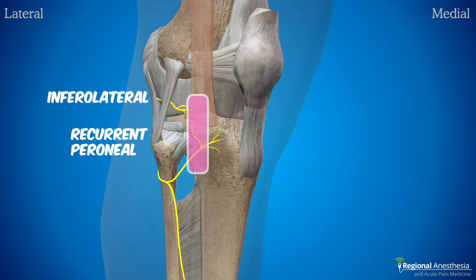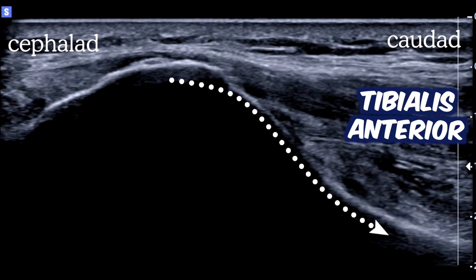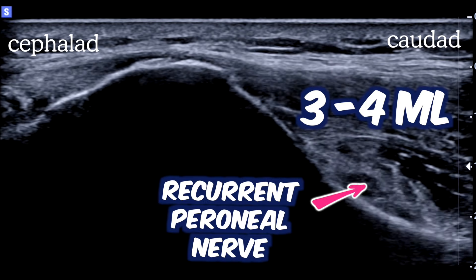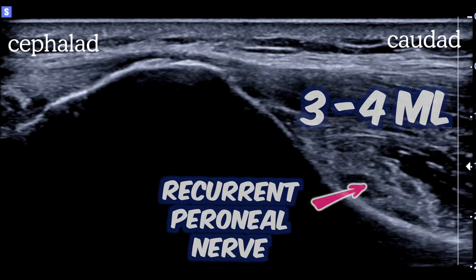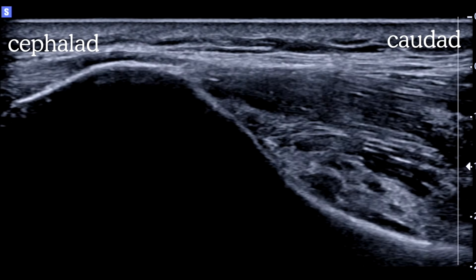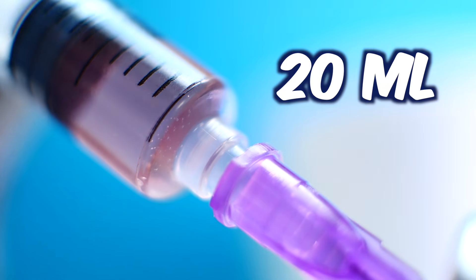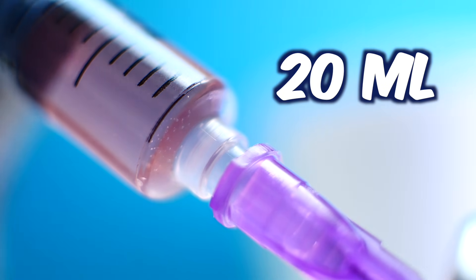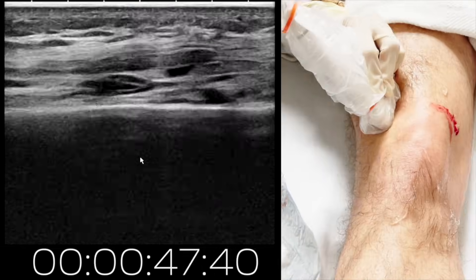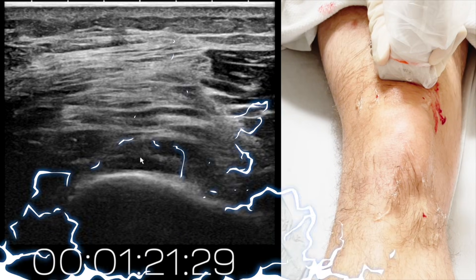Next, we'll go back to the hump and move distally. We can see the fibers of the tibialis anterior muscle and the slope of the lateral proximal tibia. We want to drive a needle out of plane down to that slope and place three to four mils of local there. We can frequently see genicular vessels to guide us, but if not, just land on the slope and lift the muscle up. We like to use a total of 20 mils of local anesthetic, preferably something long-acting — about three to four mils for each of the five blocks. These blocks are easy to do; anytime the endpoint is bone contact, it's simple to teach and learn, and they can be done in about 90 seconds from start to finish.